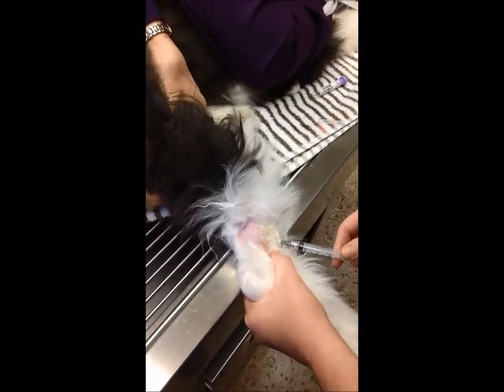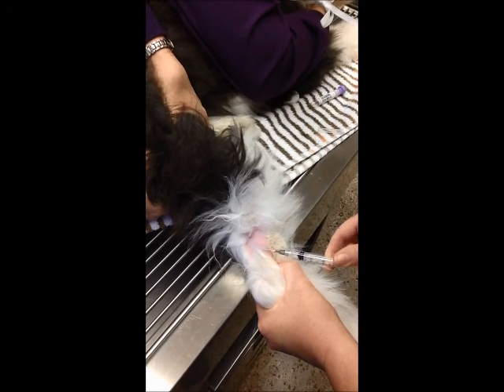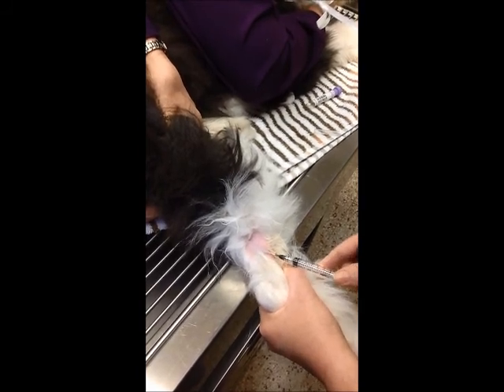Getting blood from the lateral saphenous vein. She will now bleed, which is just pushing it to the side. Nope.